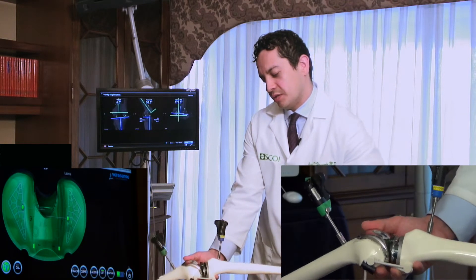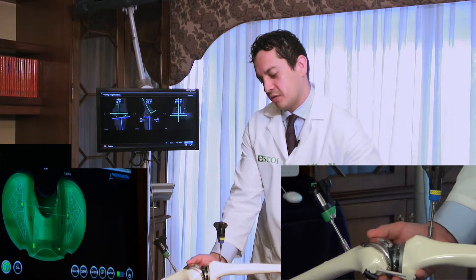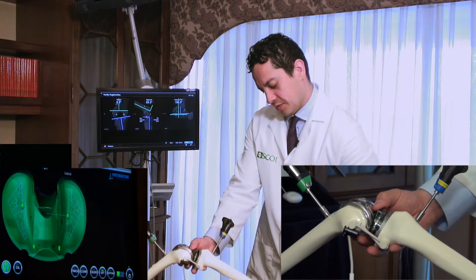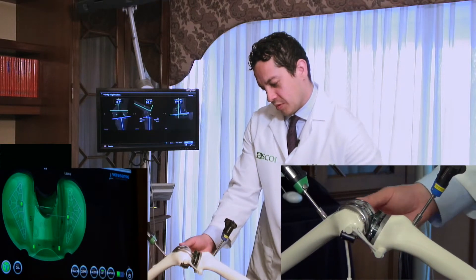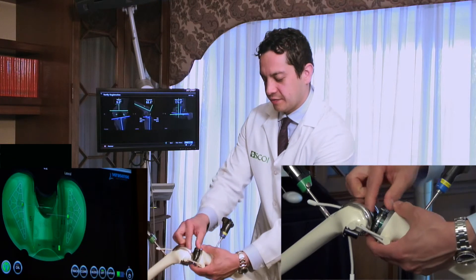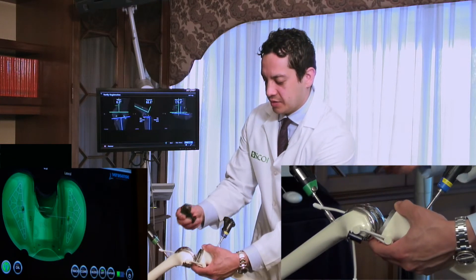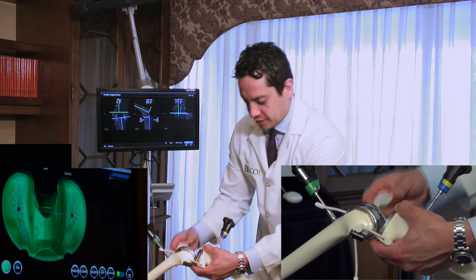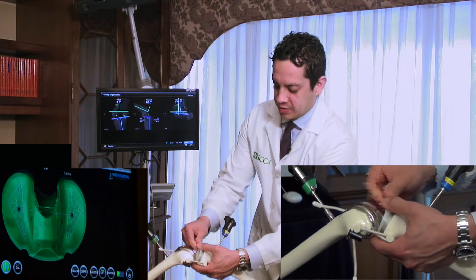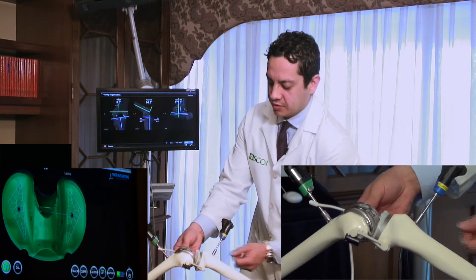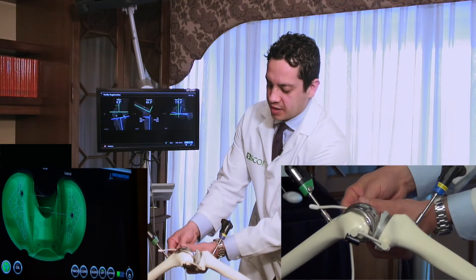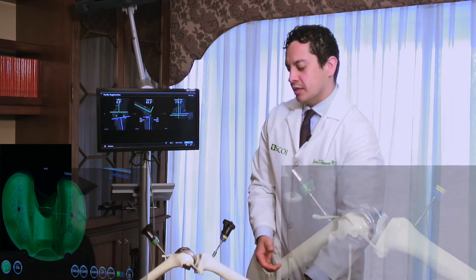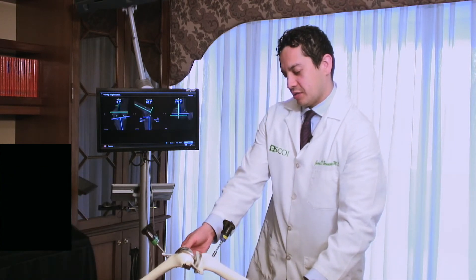Once we know the alignment is proper — totally lined up — and the pressure is equal and balanced all around the knee, we're happy. We remove the pressure sensor and put in the final piece of plastic, which serves as the patient's new cartilage, their new set of tires. Now I know the alignment is correct and the pressure is right.